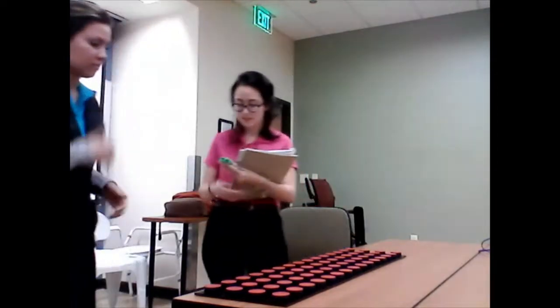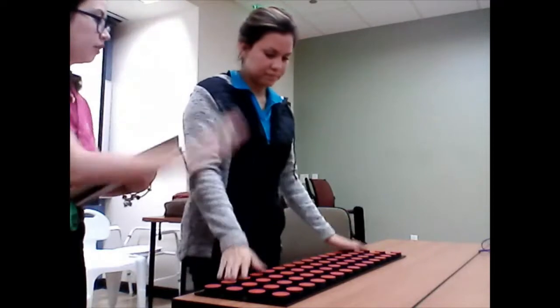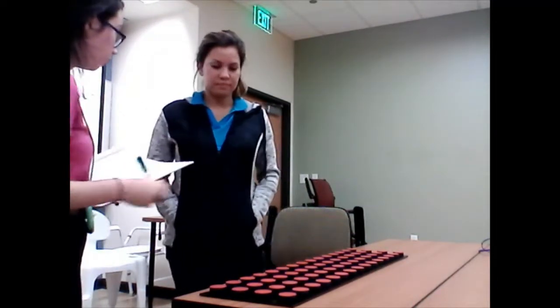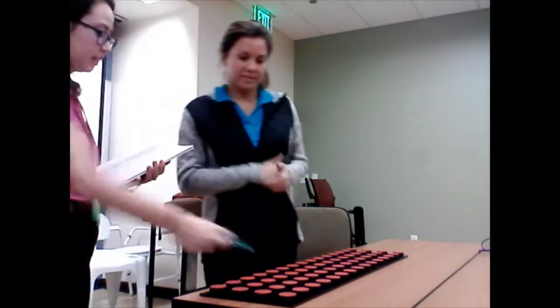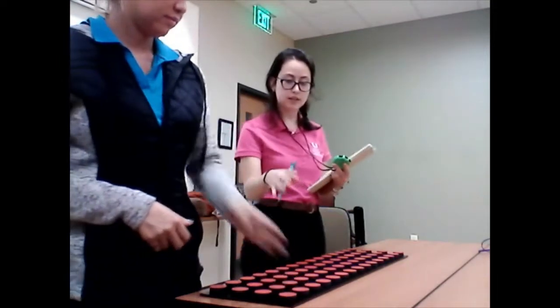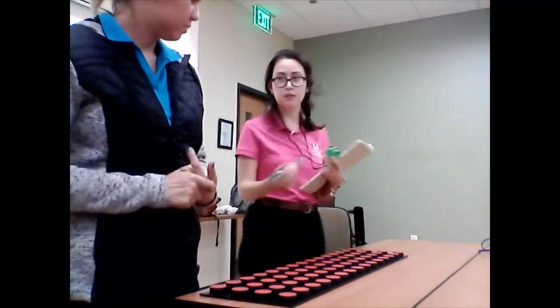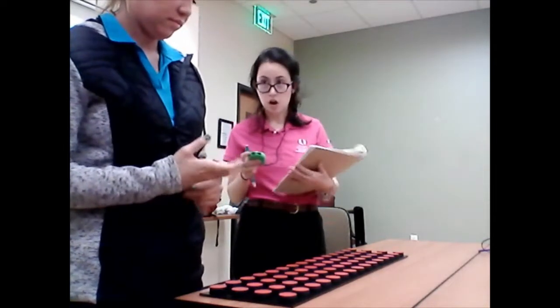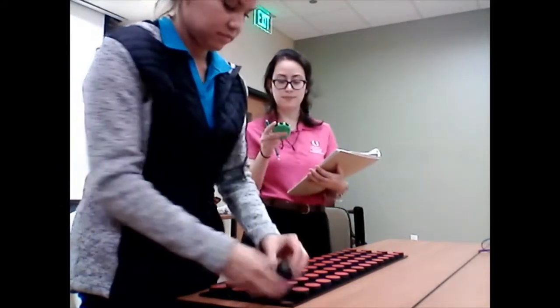Good job. We're going to do this assessment one more time, and you could leave them just as they are right now. You're going to do the same exact procedure as you did, but try to do it faster this time. I know you could do it. So please place your hand right here. And remember, you lift with your left hand and place with your right. And then once you get to the second row, you change hands. When I say go, you will go. 1, 2, 3, go.